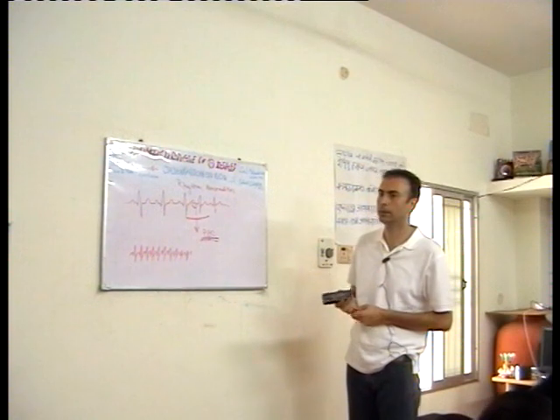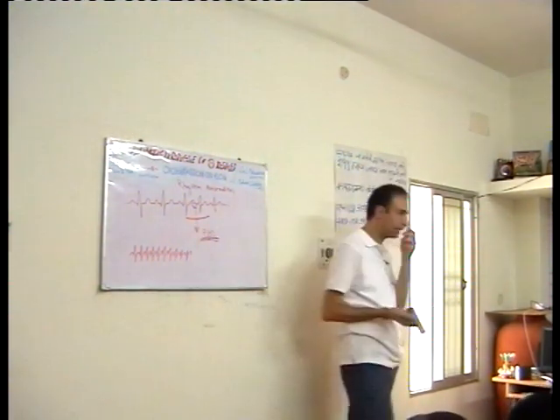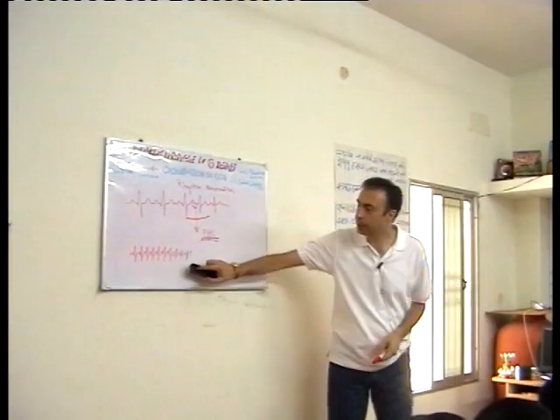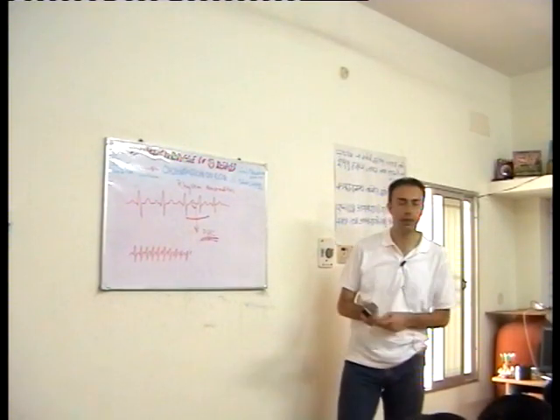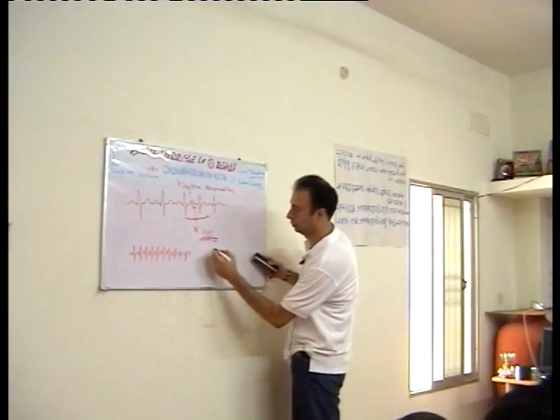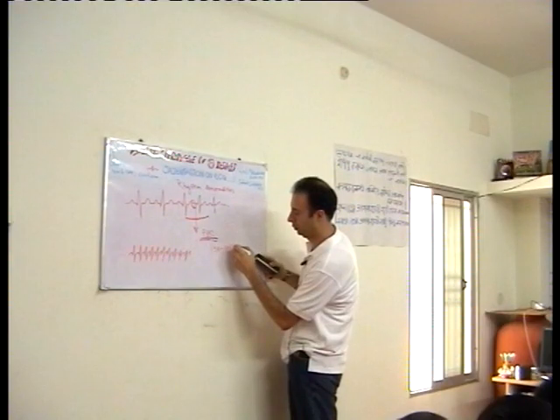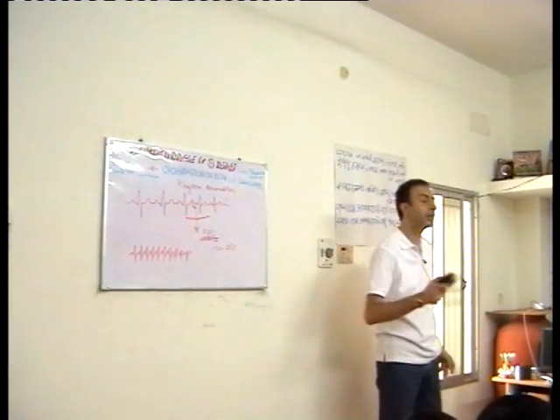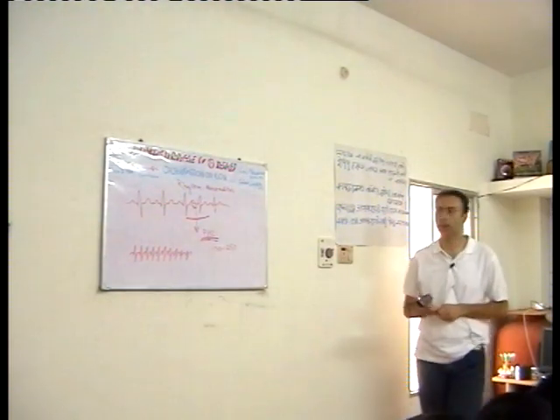SVT, sir? Are you trying SVT? It's actually, yes, atrial tachycardia. You see something in this rhythm. The rhythm is regular, more or less regular. The speed is high. Okay? Speed can be up to 250 per minute. But the rhythm is regular.